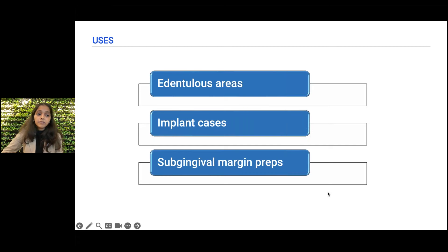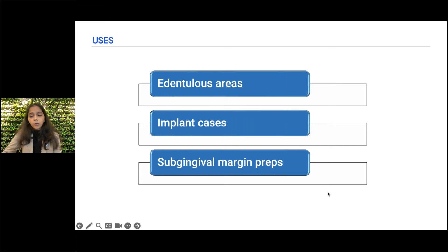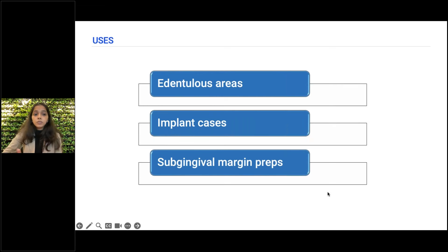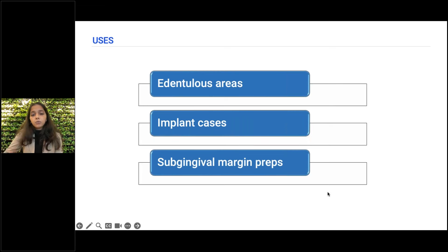You can also use it in implant cases where you want to capture scan bodies and there are moving tissues which lead to noise — to avoid this, you can play with the scan depth to scan appropriately. Additionally, you can use it in prep cases where there is a deep margin and you want to capture the whole tooth in one frame — in such instances you can use and adjust the Control Scan Depth tool.